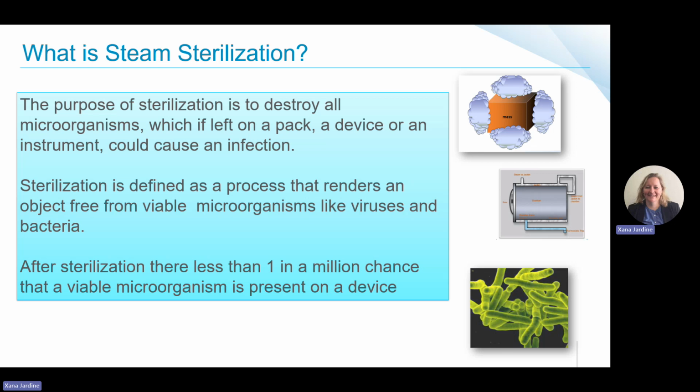At the end of the day, after sterilization, there is less than a 1 in a million chance that a viable microorganism is present on a device. And that's our whole goal, isn't it? To kill all of the microorganisms. And this description encompasses all forms of sterilization. But let's focus now on steam sterilization specifically.